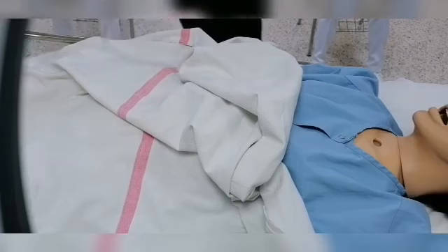for the certain procedure. So for the dressing, we have to prepare the dressing set. It is different according to the type of the wound. So prepare the dressing set, and also prepare the solution which is needed.